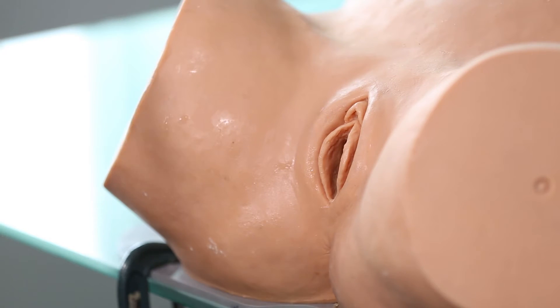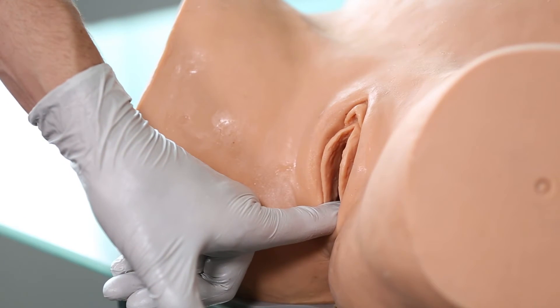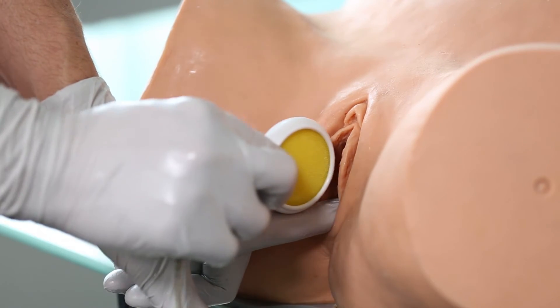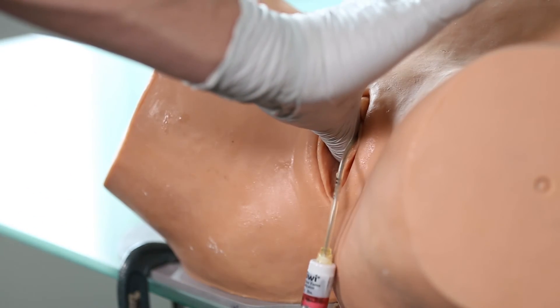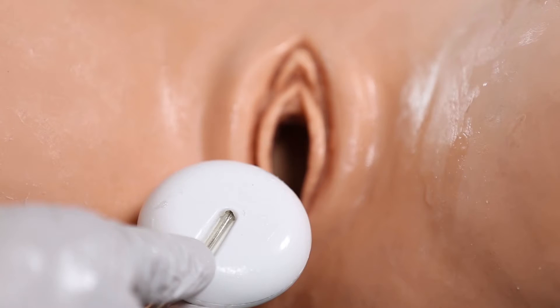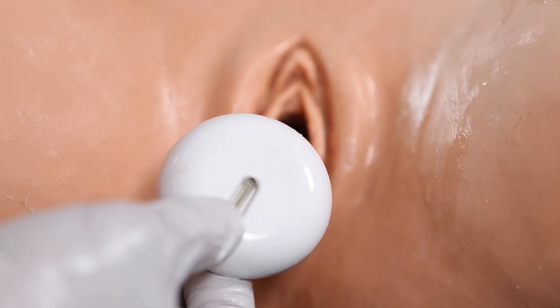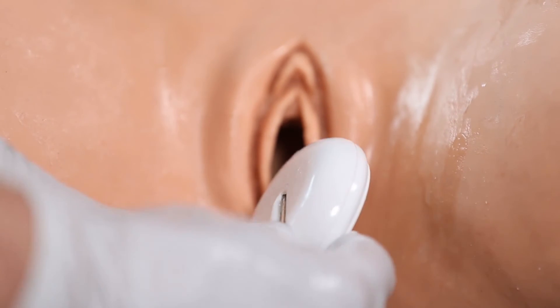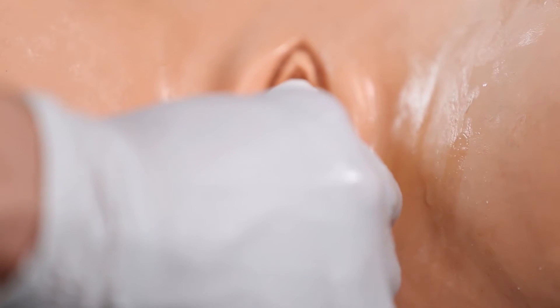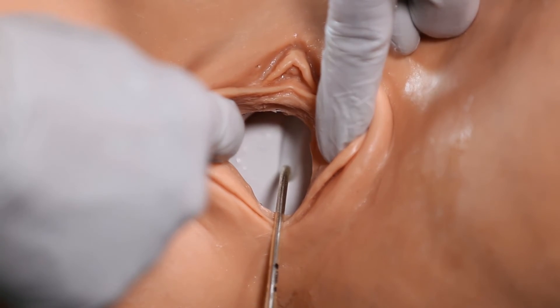Step number two is to hold and insert the cup. Place one or two fingers in the vagina, pulling downwards to create room, then slide the cup on its side as small as possible. Once it's flat against the fetal head, rotate it up flat and remove your hands. The easiest way to keep track of the groove is to place your thumb on top of it. When the cup is inserted into the vagina, the groove goes in at nine o'clock, and as the elbow is rotated upwards, the groove is naturally placed at 12 o'clock.